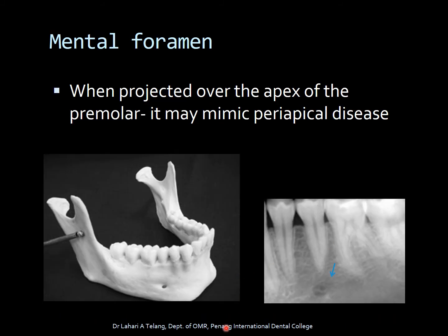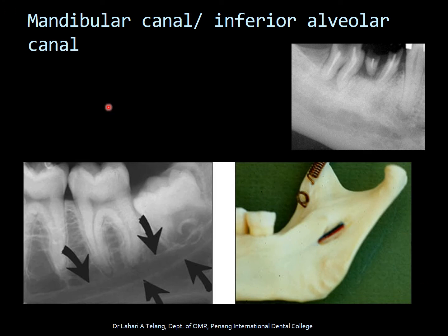The mental foramen is an important landmark — this is where the inferior alveolar canal exits with nerve endings. When projected over the apex of the premolar region, it may mimic periapical disease, so it is important to note that it is seen somewhere between the premolars, sometimes in very close proximity to the apex of the premolar in the mandibular premolar region. The mandibular canal, also called the inferior alveolar canal, is where the inferior alveolar nerve passes through. It is an important landmark, especially when placing an implant.